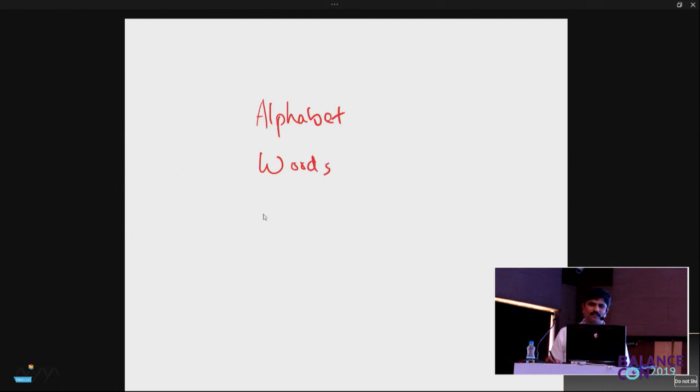When we talk about videonystagmography interpretation, this has to happen in 3 steps. First is understanding language. What are the 3 things we do? First we know the alphabet. Then using the alphabet we write words. And then using the words we make meaningful sentences. In videonystagmography, the alphabet is 3.